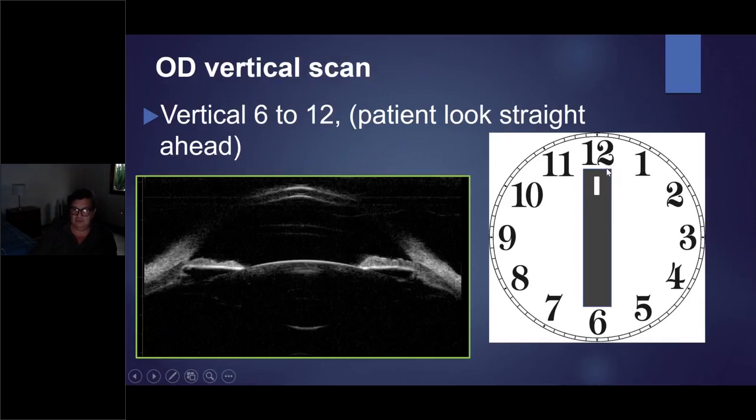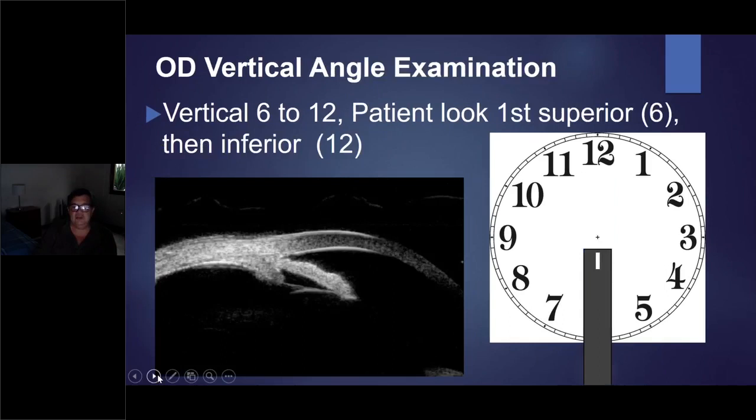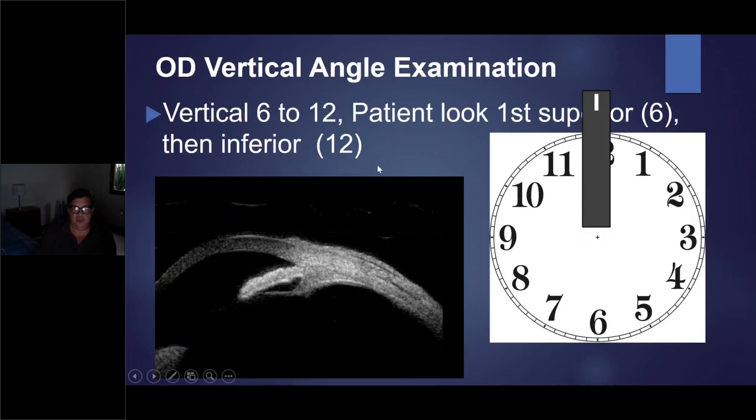And then in the vertical again, you can see the same image, but it's 6 in the left side and 12 in the right side because the marker is facing 12. Then this is the vertical, and the patient looks straight ahead. 6 is on the left side, 12 is in the right side because of the mark. And I ask the patient to look up, superior. Then I make the examination for 6 hours. Then I ask the patient to look down, and then I examine the superior angle, the 12th hour.